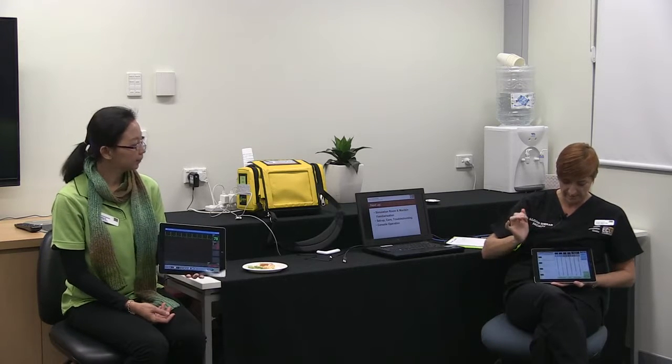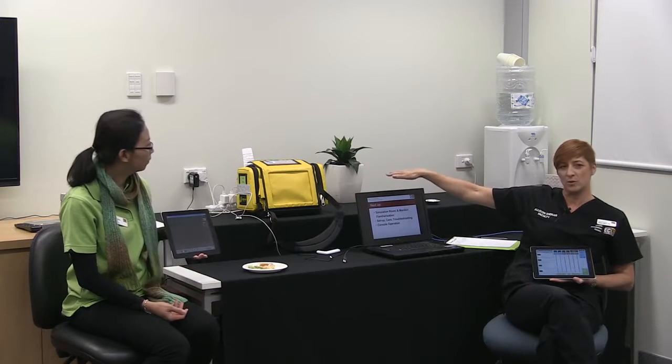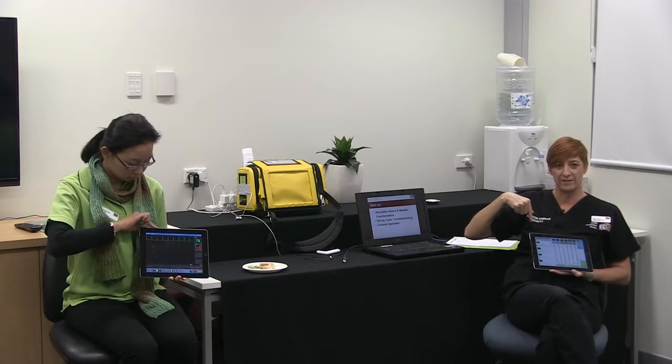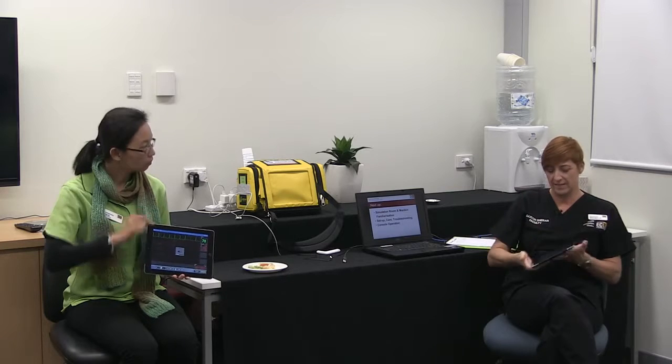We're just going to do a BP. It does come with a SATS probe, simulated defib leads, and simulated chest leads, but the software all comes from here. This is a wireless piece of equipment — it's got to be plugged in unless you put the little dongle in. So it's great in the SimCenter, but if we wanted to use it outside or on another floor, we'd have to put the little dongle in.